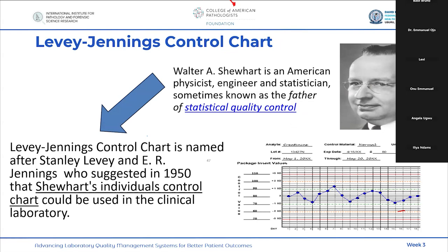So to start with, I will start with the last one, the application of the Westgard rule, how possible it is and all of that.